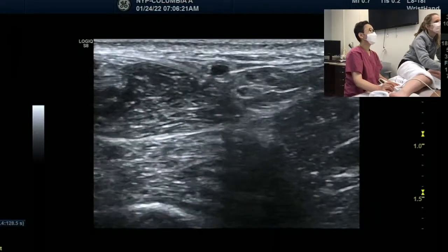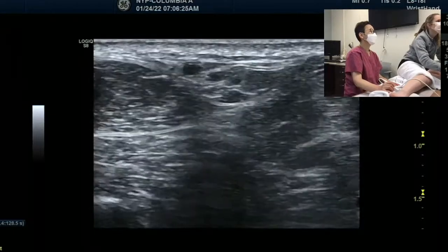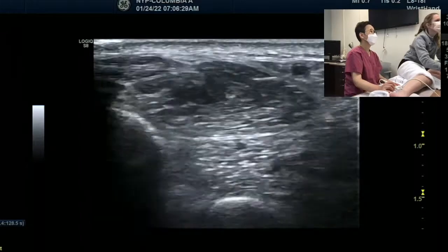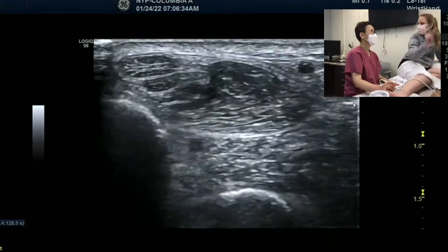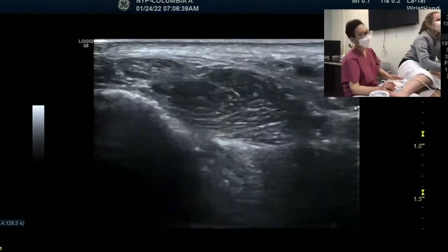You can see sort of the fibrillar pattern. No, Achilles tendon, not the fibula, Achilles tendon. Right there. There's the fibula on the left side. Fibrillar, like the echo texture.